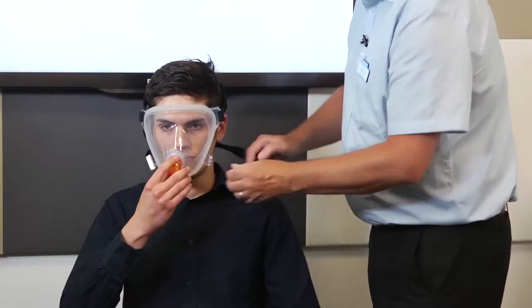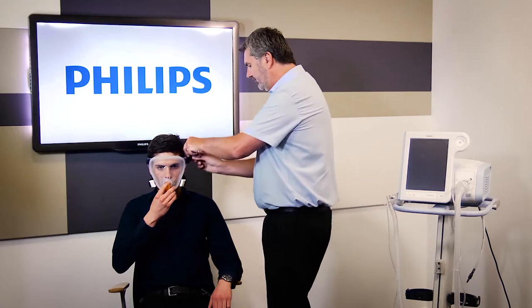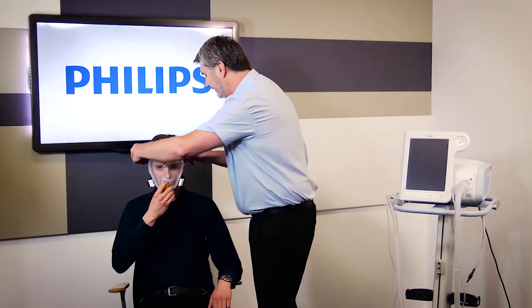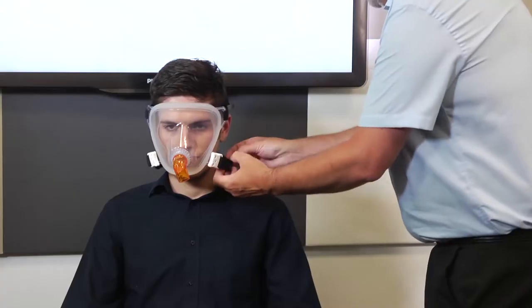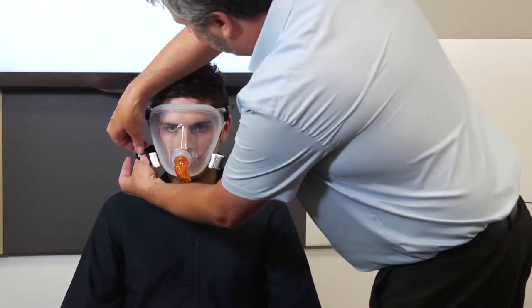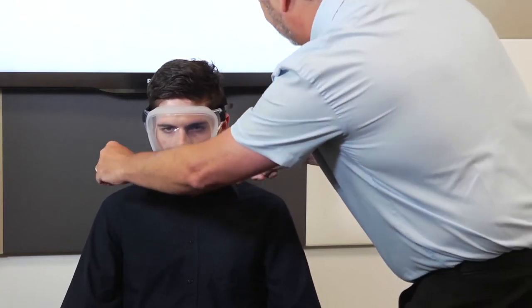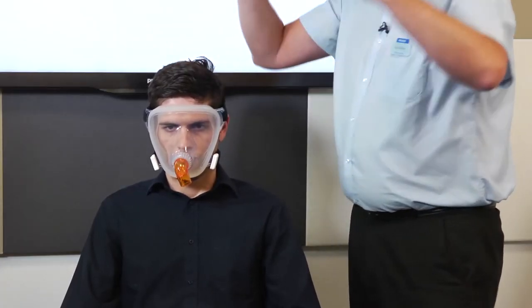I've put the two on the top, then I'm going to clip in the two at the bottom. It's very important to do the two at the top first and then the two at the bottom. All you need to do is just pull through until you feel that it's rather firm on his forehead. At that point, if it is tight enough, the patient should be able to let go. Then you look through, undo the two at the bottom, looking through the mask, making sure the bottom part is below his lip. Then just gently do the two at the bottom at the same time, so you've got the same tension either side of the mask. There's a little extra one at the top just to make it a little bit more comfortable, giving a bit of a cap feeling.